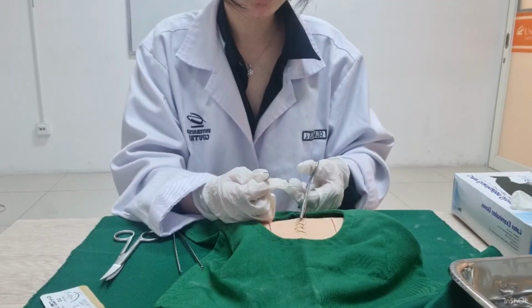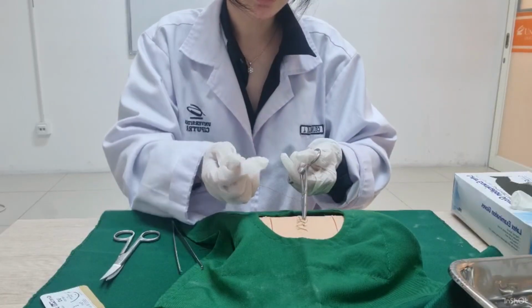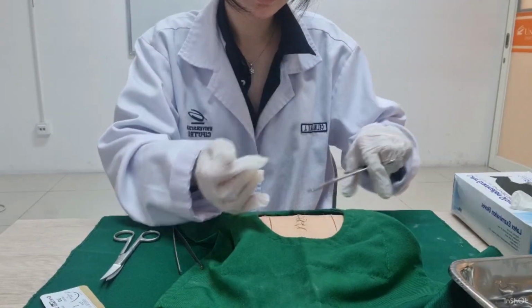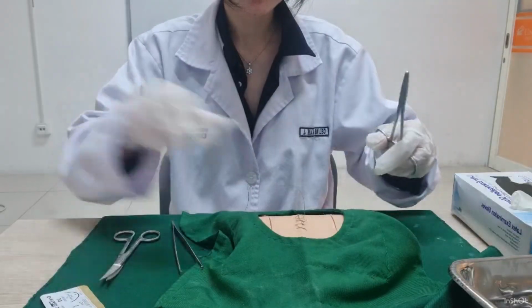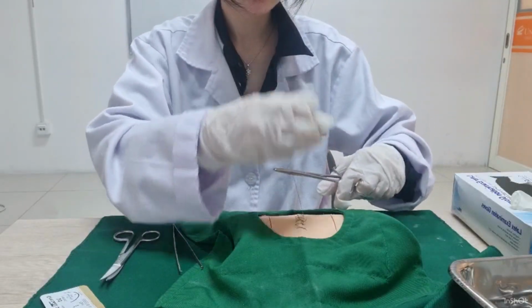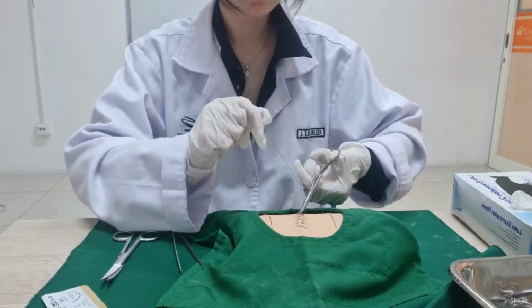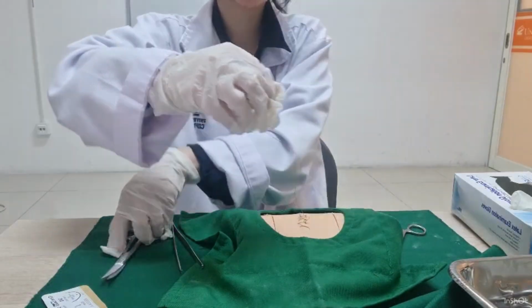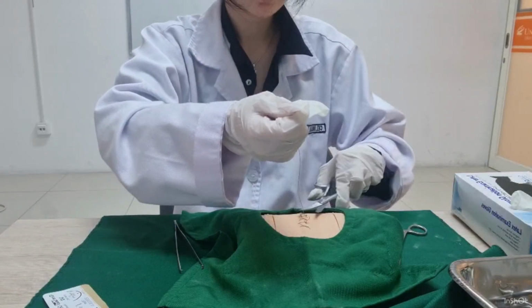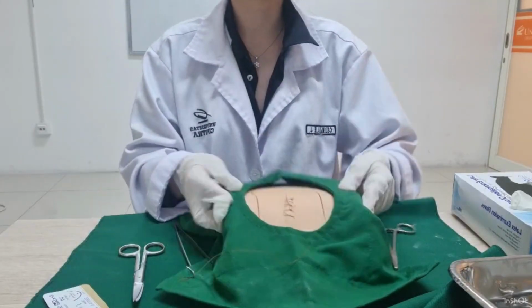Okay, so I'm going to close the suture now. I will tie a double knot and tie the suture over here. Okay, now I will cut the excess suture. Okay, so we're done with the simple continuous suture.